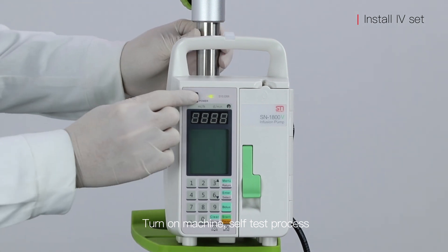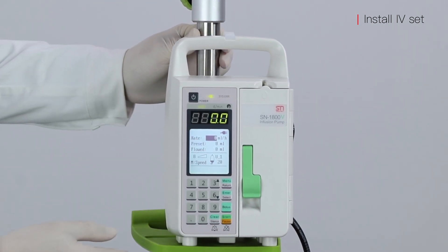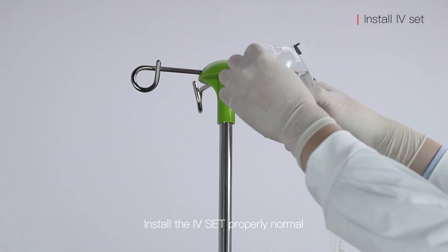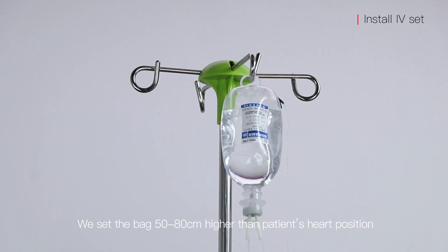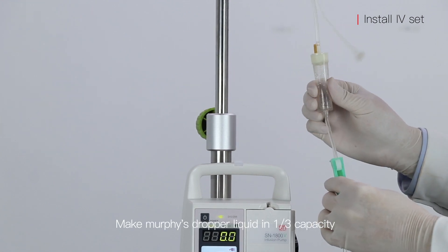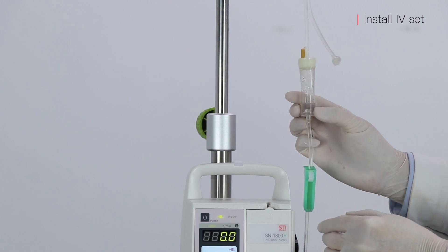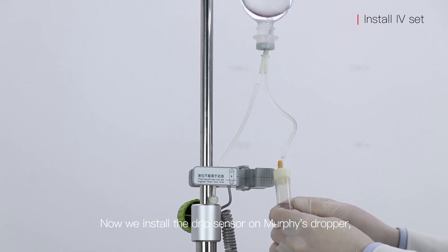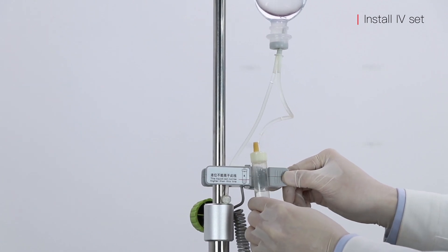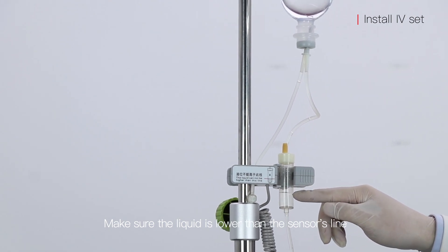Turn on the machine self-test process. Install the IV set properly. Set the bag 50 to 80 cm higher than the patient's heart position. Fill the drip chamber to one-third capacity. Now install the drip sensor on the drip chamber, and make sure the liquid level is lower than the sensor's line.